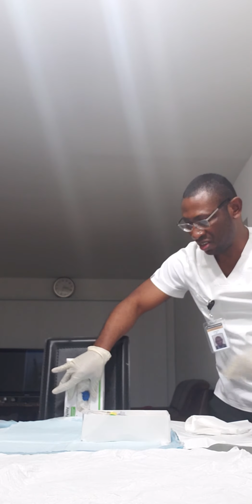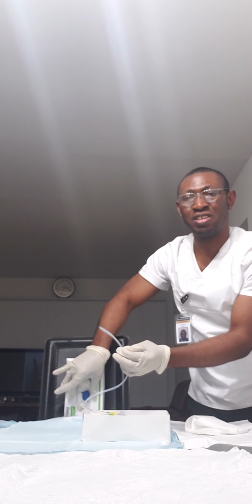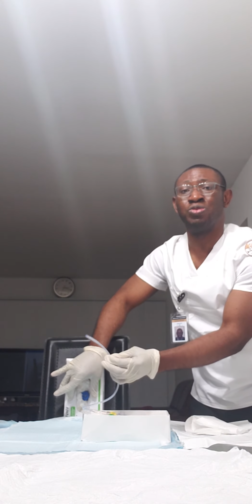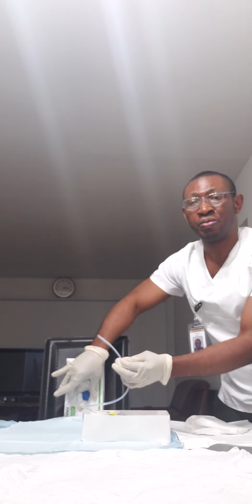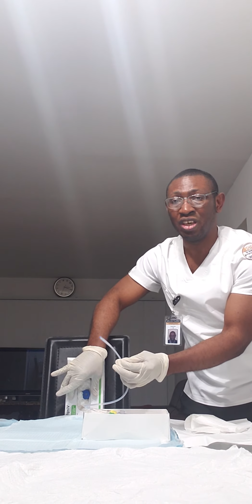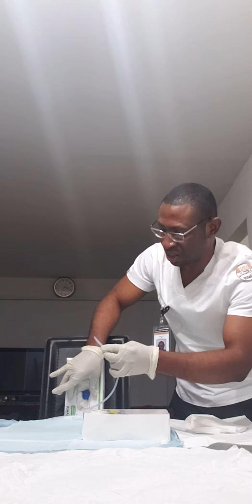And the next thing is to insert the Foley. While inserting the Foley, if it is a male, I have to insert it 7 to 10 inches. And once I see the flash of urine, I'll insert an extra 1 to 2 inches. But if it is a female, I'm going to insert 2 to 3 inches. And once I get the flash of urine, I'm going to insert an extra 1 to 2 inches. Okay, hold it very tight and go ahead.